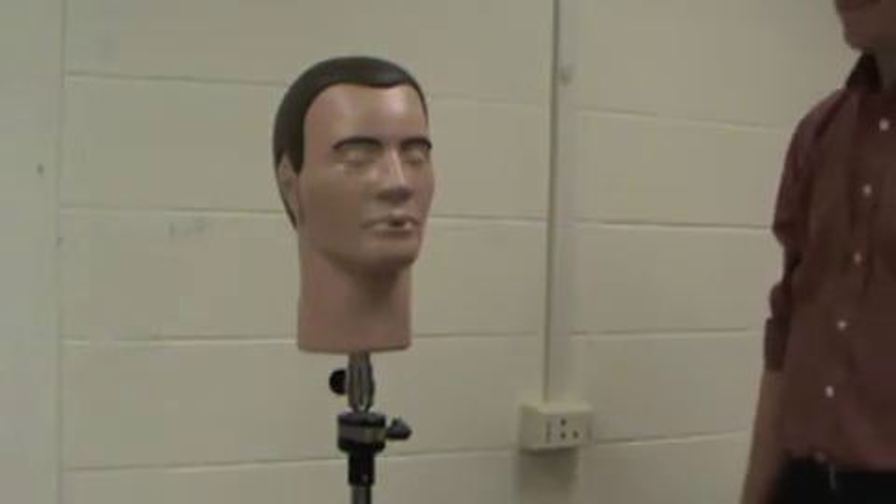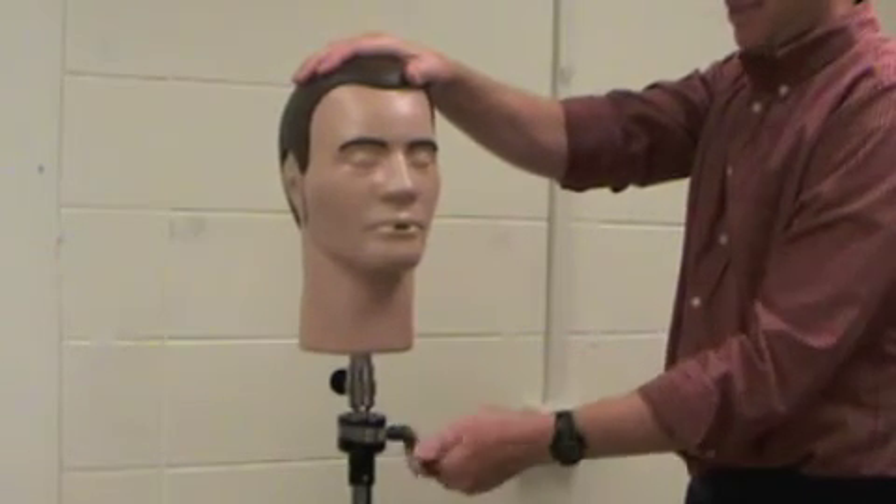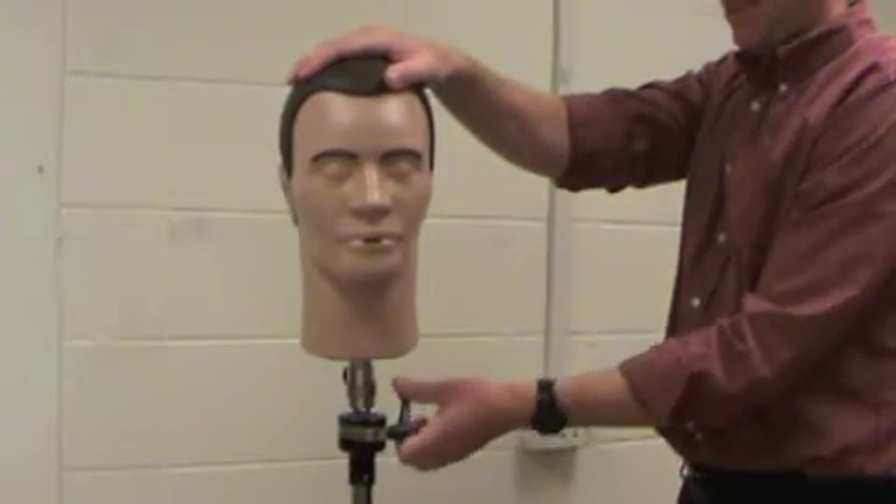Tighten the handle. To adjust Pan-Dexter, support Dexter's head, loosen the black lever handle at the top, arrange his head into position, and tighten the handle.